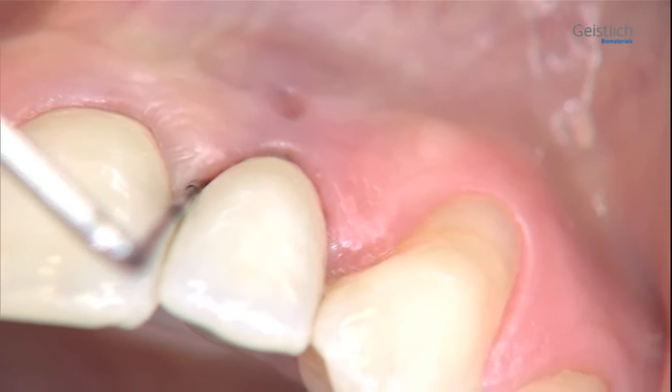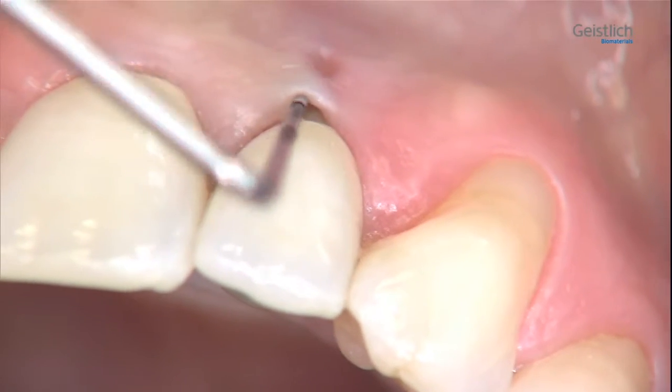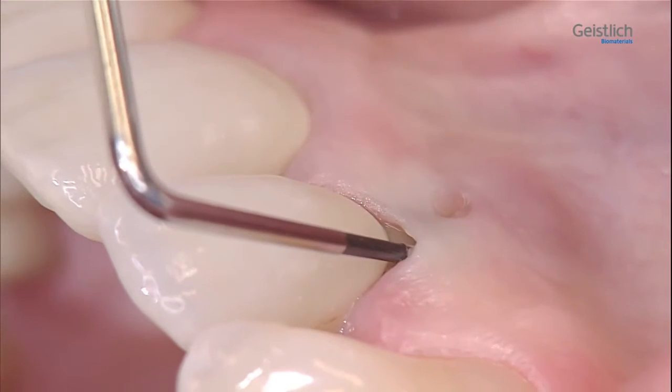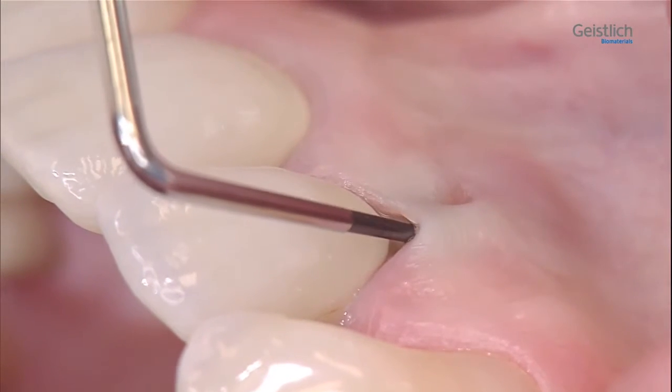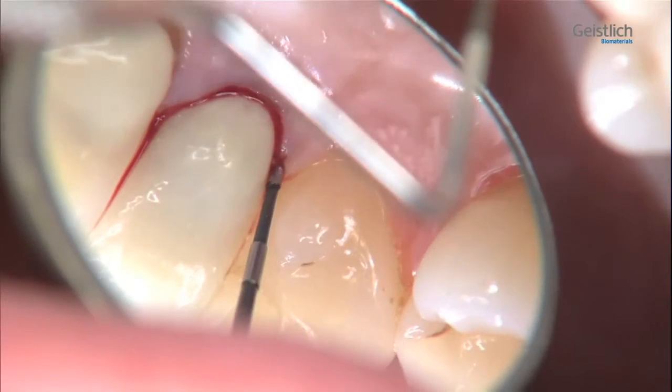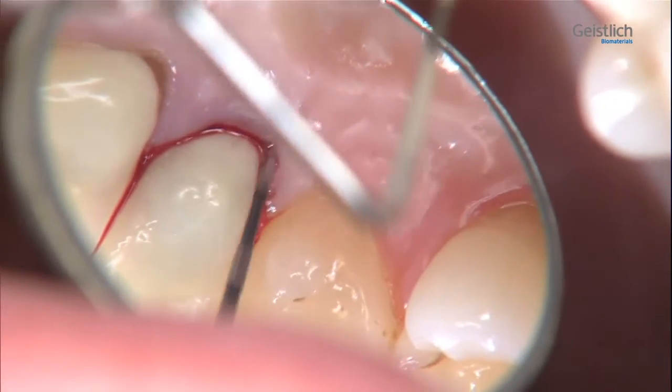With a periodontal probe, we explore the bone around tooth 2-2. The loss of the buccal bone plate is clearly palpable, while sufficient bone is still present on the palatal aspect.